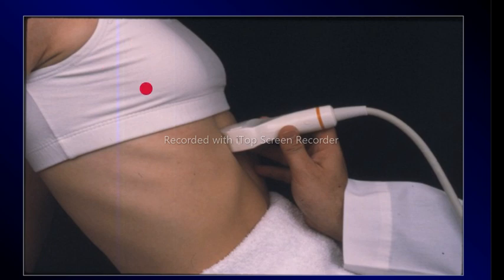This is a patient in semi-erect position, and you can see this position helps us to deal with gas. Remember, when your patient is lying supine and straight, gas moves up and occupies the anterior aspect. So when they sit up like this, gas moves towards the diaphragm and frees this area away from gas. Sometimes this technique works, sometimes it doesn't.